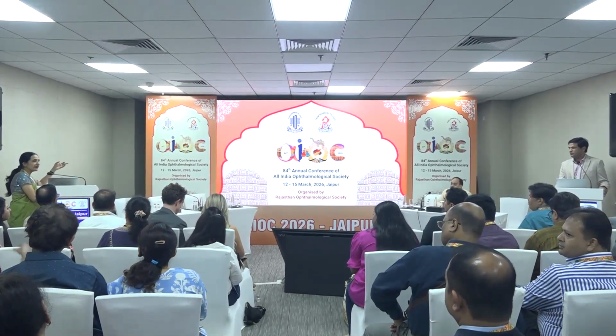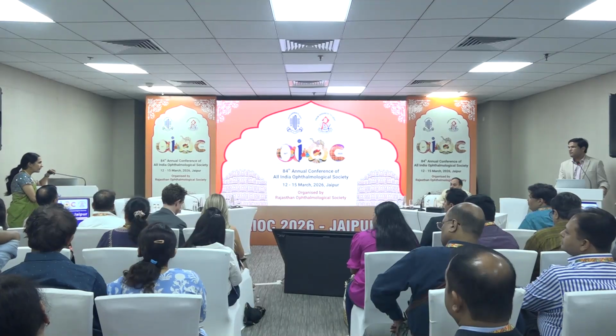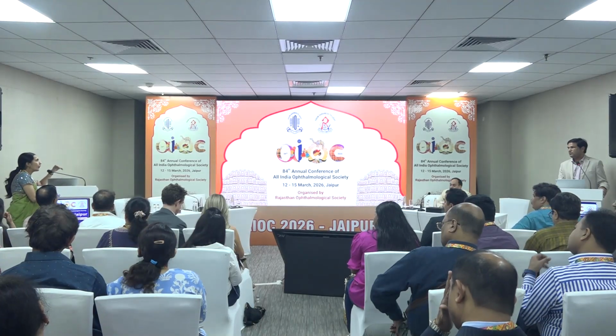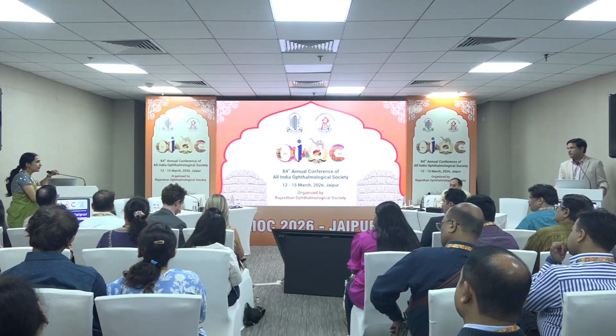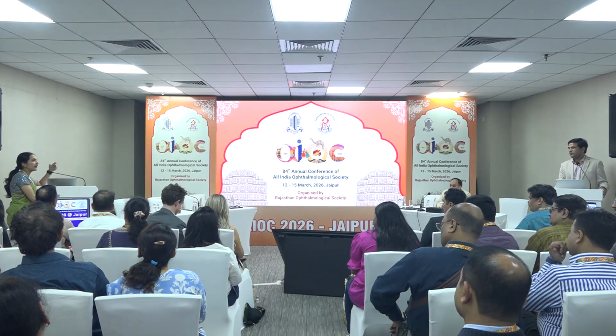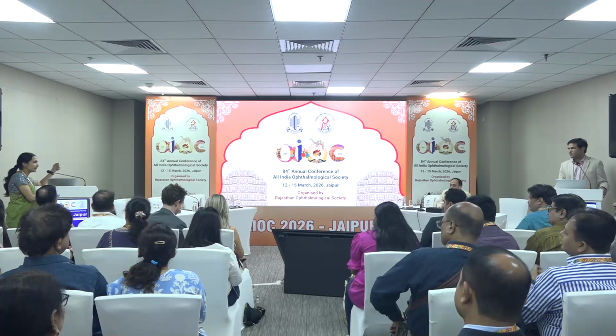So I think preparing is very important because it also helps in counseling the patients that you are an off the normal or an off the standard eye. So you might end up with a little more than what we targeted, more or less. So we cannot 100% target.